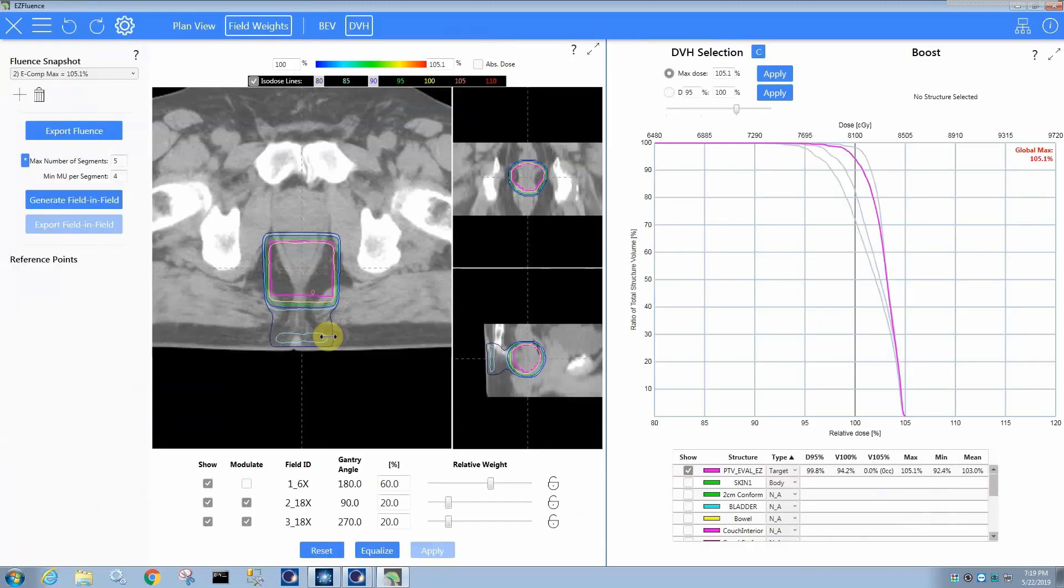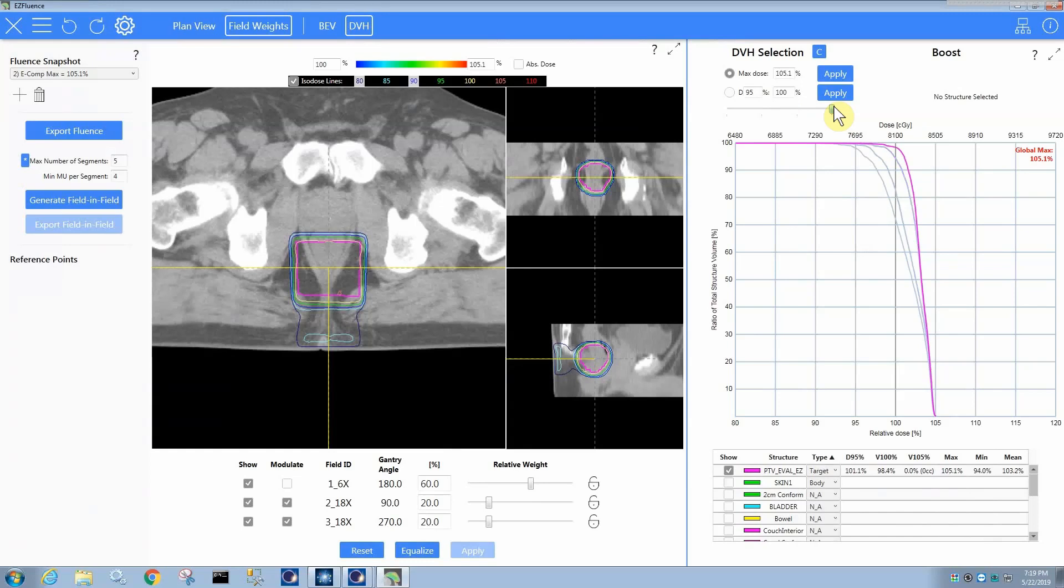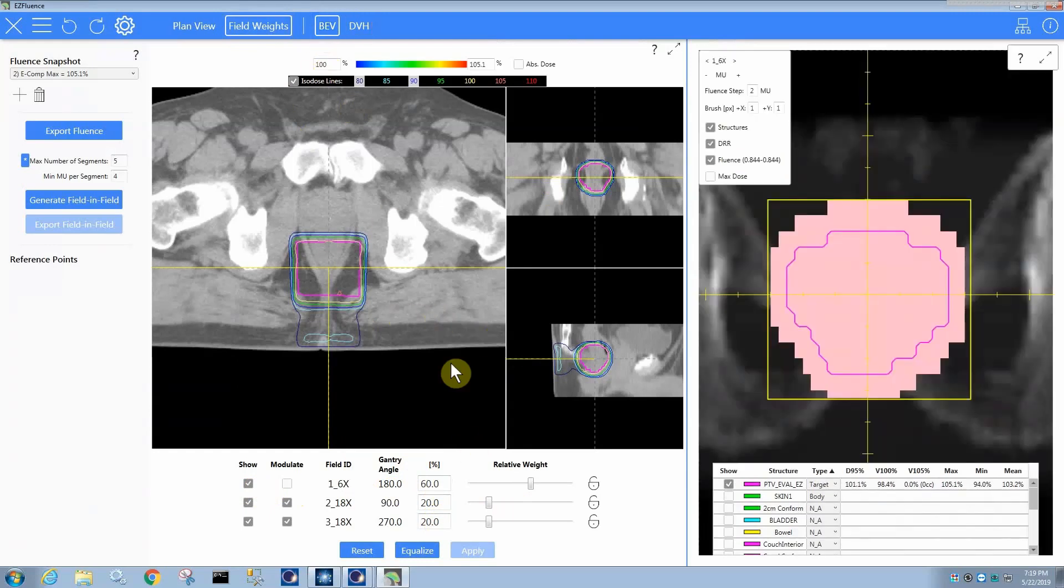And we have our plan. So now we can, of course, select which plan, which curve you like. I'm just going to pick the one that has the most coverage. You can see that it has our relative field weights down here. It has this one as not modulated, this field right here. And then the 60%, 20%, 20% field weights are here as well.